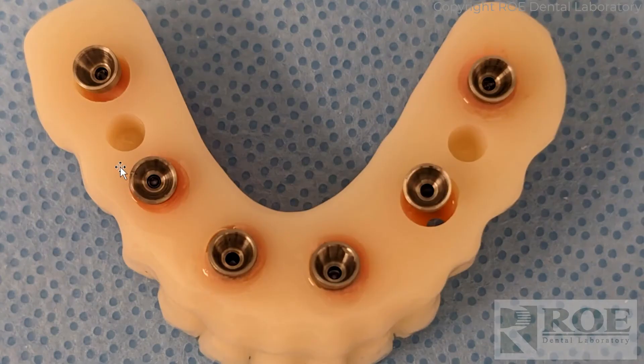What we did here was fill some voids before we addressed the conversion. We want to make sure there's enough material in here to ensure all these temp cylinders are totally intact — we don't want them coming out during the C2F conversion.